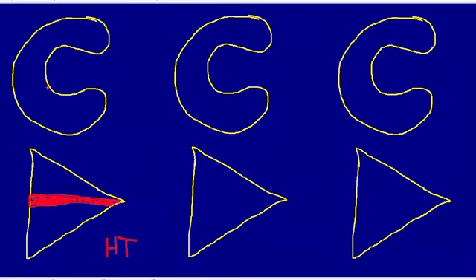In the axial plane, you won't be able to see this tear because it is running in the same directionality as the axial plane. Now, the main complication of the horizontal tear is that fluid from the joint will be able to seep through this crevice and pop out the other side, forming what's referred to as a parameniscal cyst. So the complication of the horizontal tear is a parameniscal cyst.